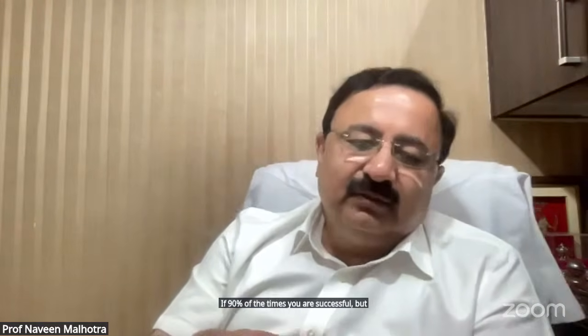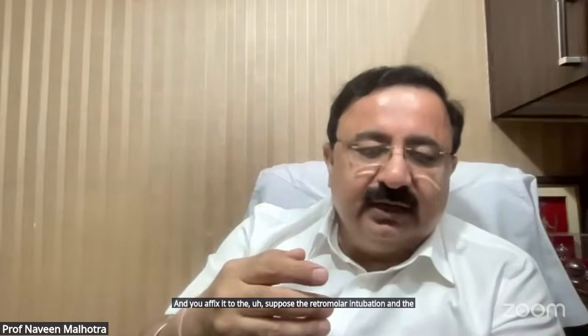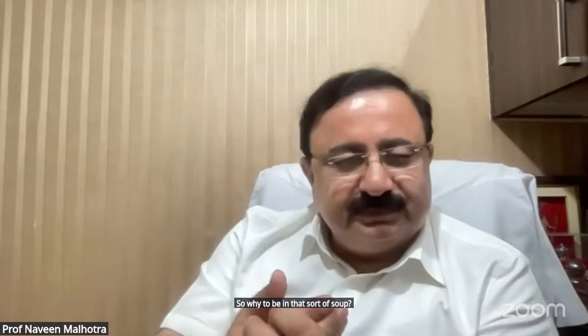It has been used. I know, but if 90% of the times you are successful, but once you imagine that it gets kinked, suppose it's the retromolar intubation and the tube gets kinked and you have already fixed it. Surgery is going on. So why be in that sort of soup?